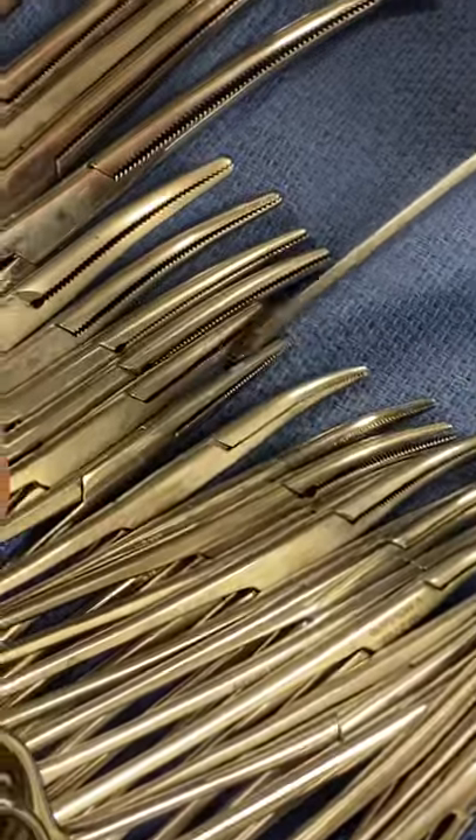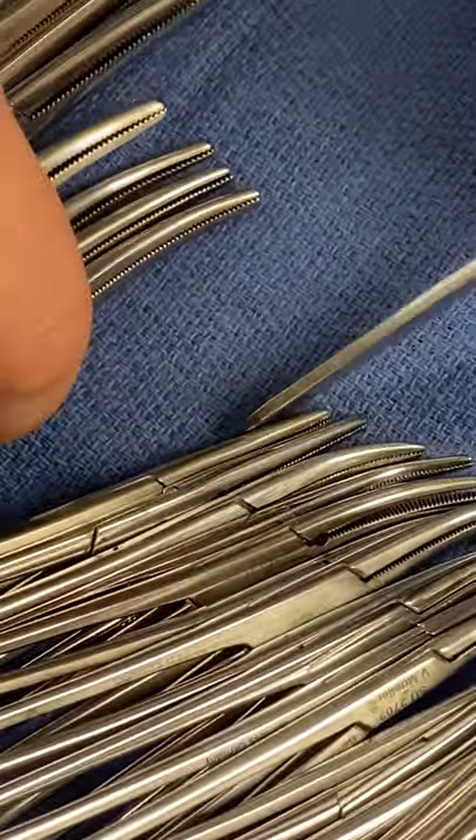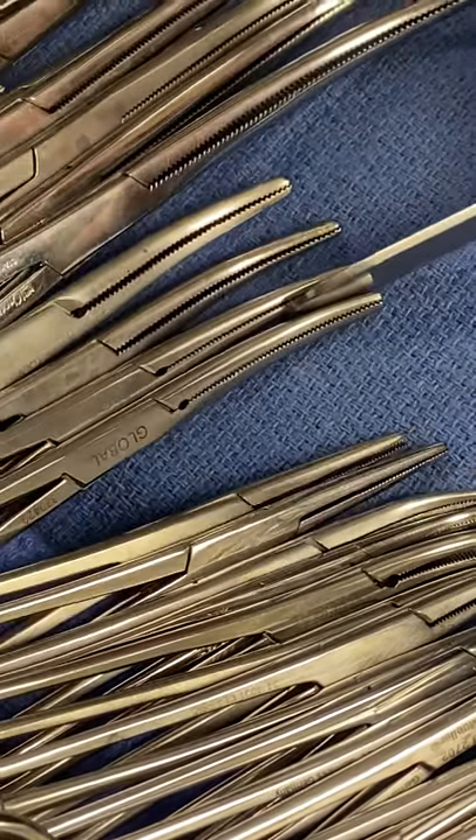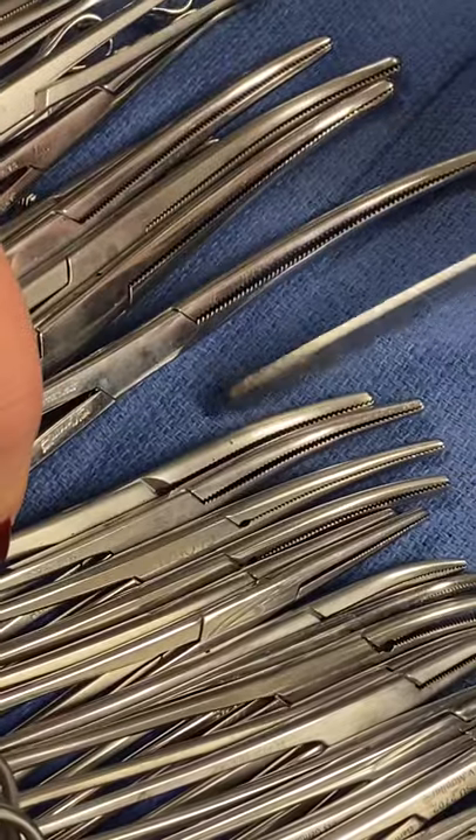And then straight hemostats, one and two. Straight hemostats, two. And then mayo peons, one, two, three, and four. Four mayo peons.